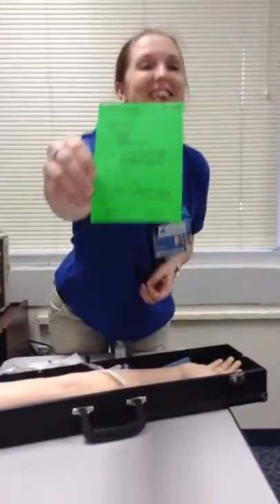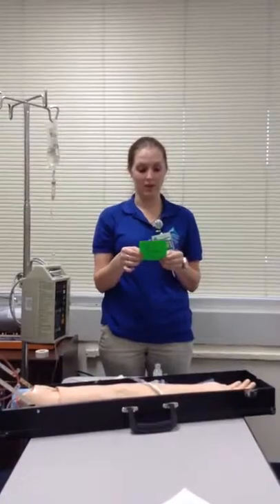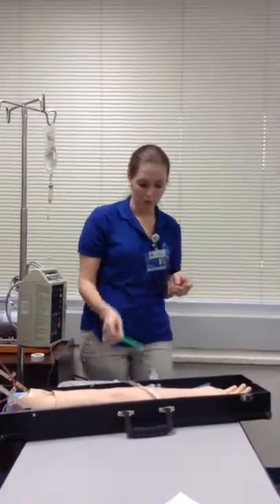drop factor of 10. So I took my math, and it's 100 milliliters over 60 minutes times 10, which gives me 17 drops per minute. And there's my math. Okay, thank you. And one thing, some adverse effects is a super infection. So we're going to go ahead and get going.